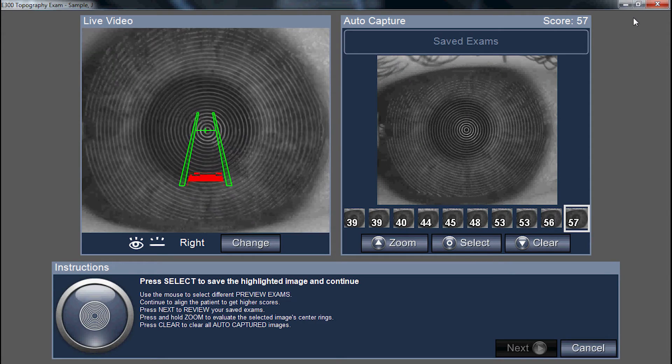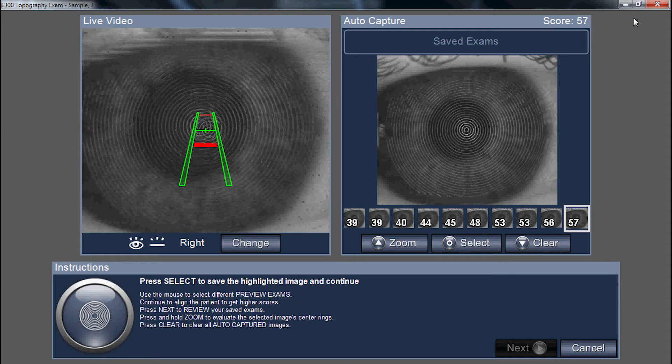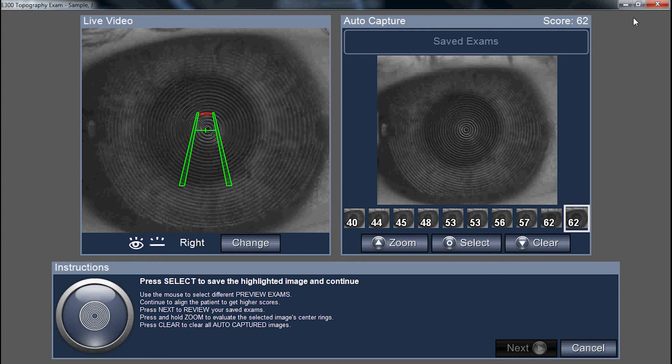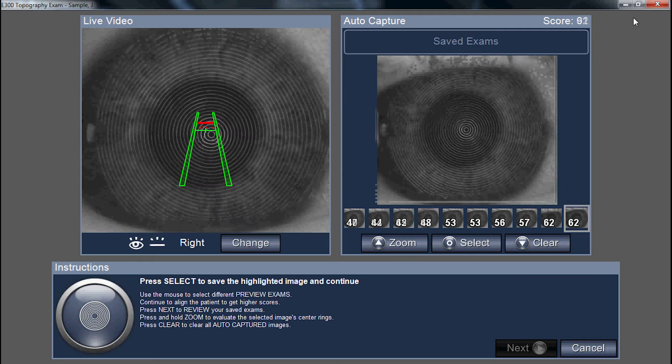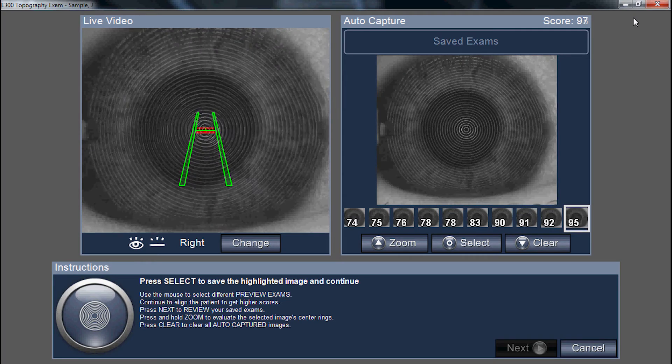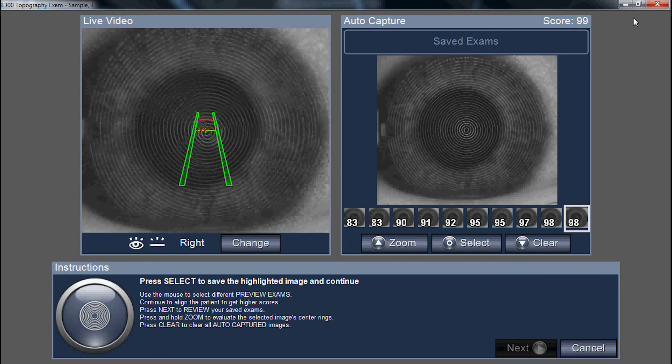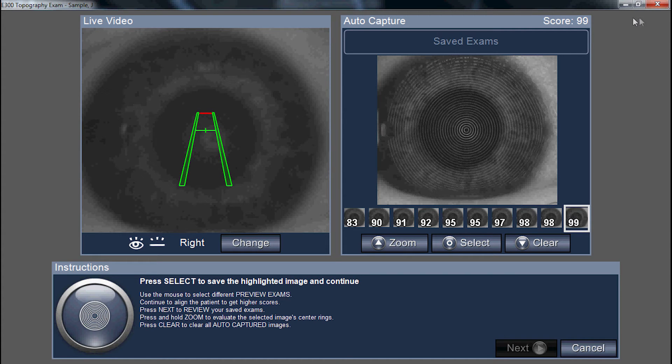Prior to doing so though, have your patient blink, smooth out the tear film, and open up as wide as possible. The instrument automatically captures when you've centered it within range.